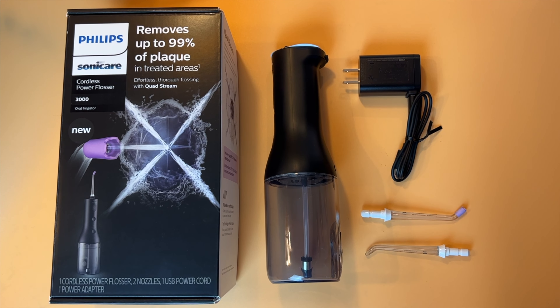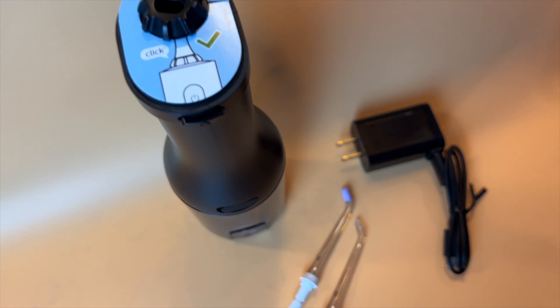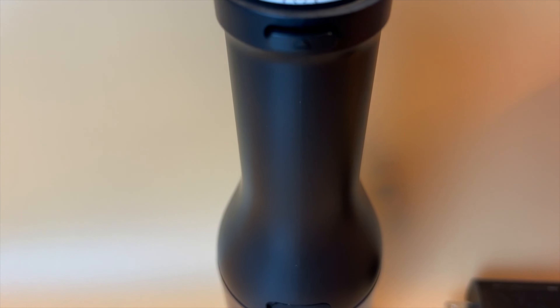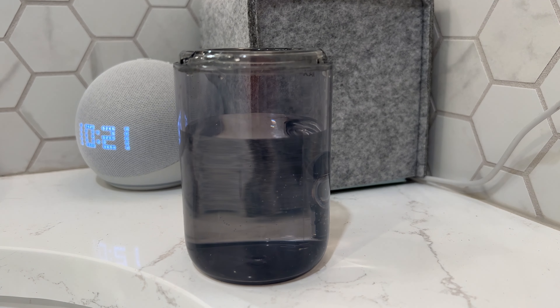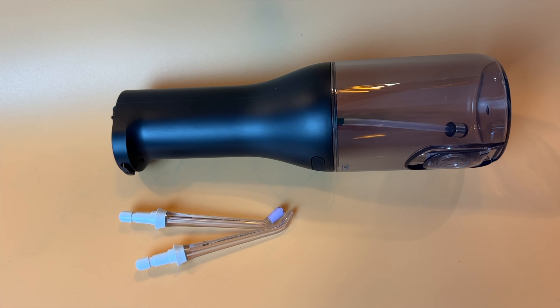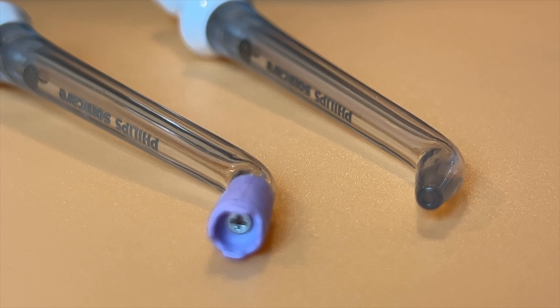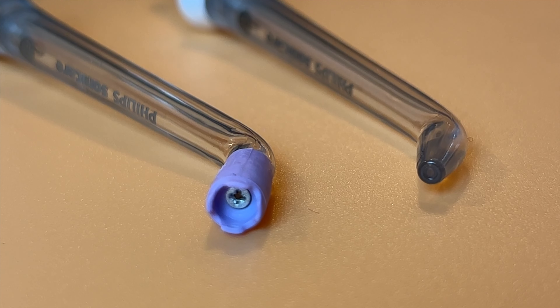Let's take a look at what's in the box. The package is pretty pared down. You'll get the large power flosser device, which is made up of two parts: a handle with all the buttons and controls and a clear plastic water tank on the bottom. Also included in my kit were two different flossing nozzles — an F1 standard nozzle as well as an F3 quad stream nozzle, which has a rubber end.